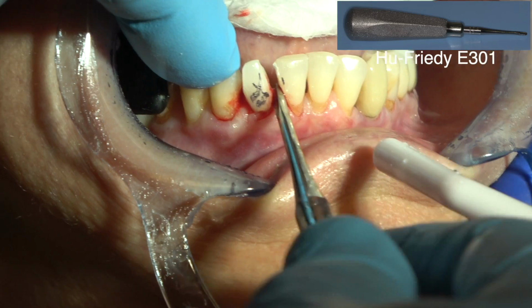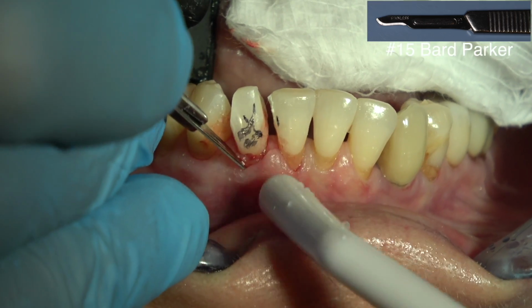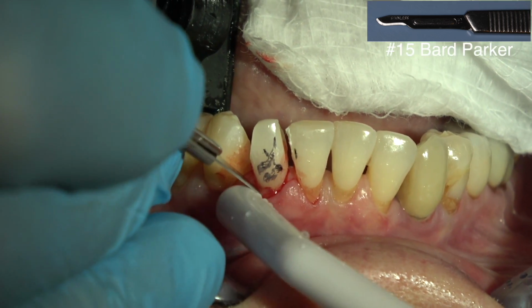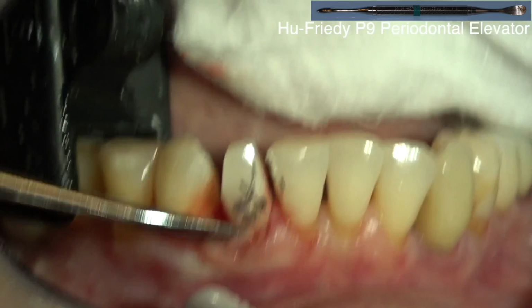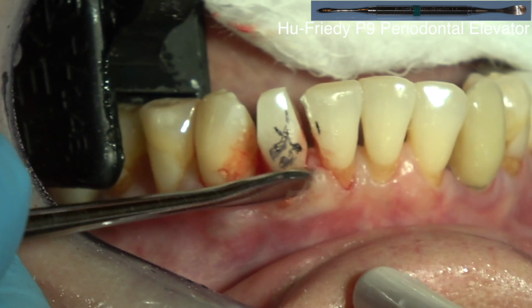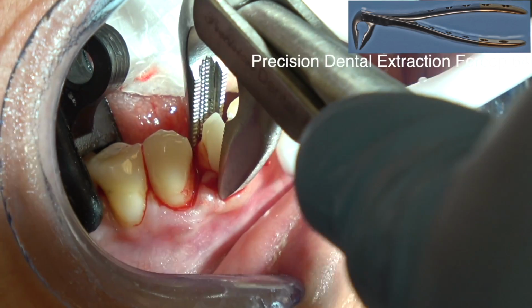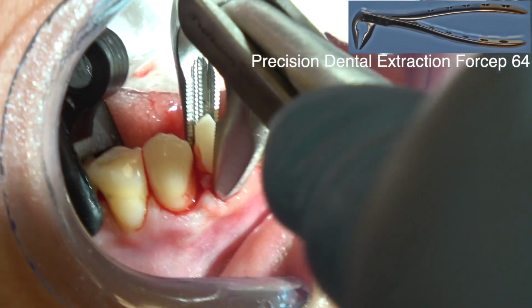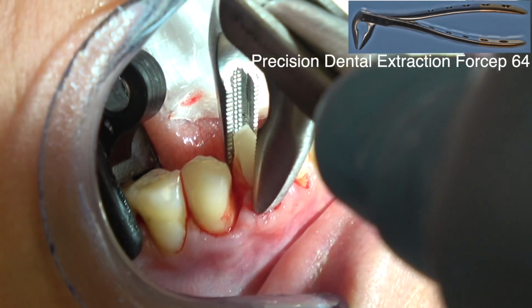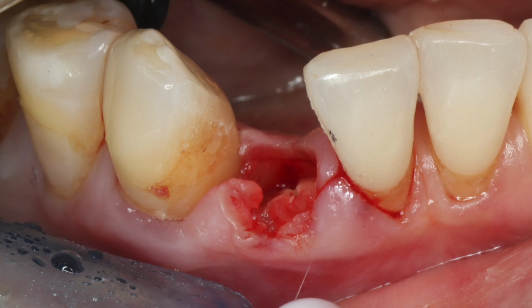I'm going to make an incision, and the reason I'm making this incision, I want to be able to visualize the alveolar crest because I'm hoping I can place the implant at the time of extraction. And if I do, I want to place the threads of the implant at the alveolar crest. So I'm just trying to unscrew the tooth, and it does fracture at, you can see the tooth right here. It fractured at the line of the internal resorption, which is to be expected.